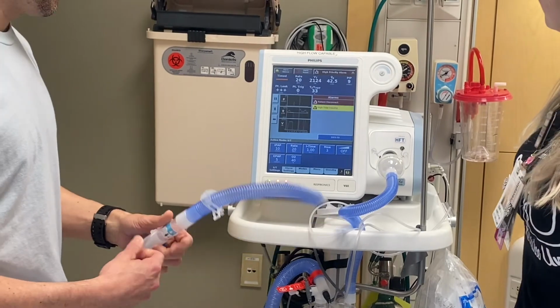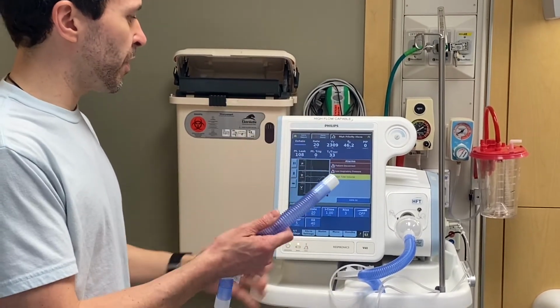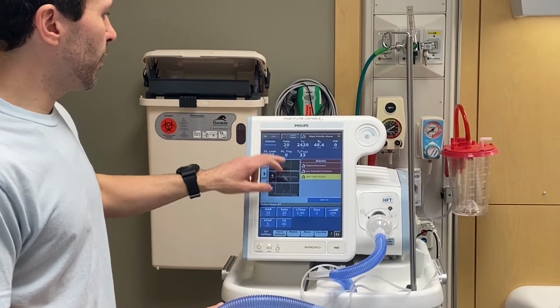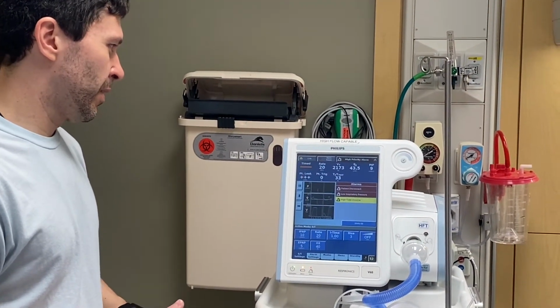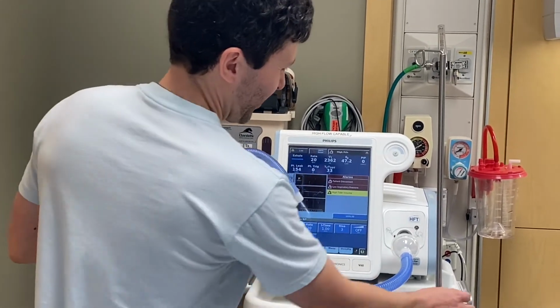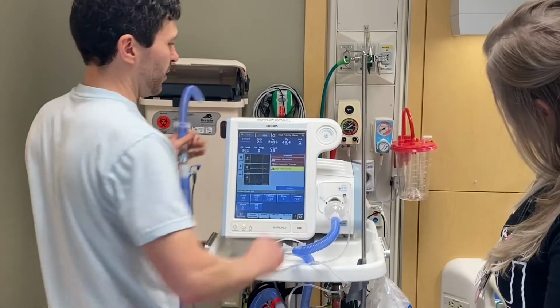It typically does. If you see patient disconnected or proximal line disconnected, and you are staring at the patient and the mask is on and everything's running, that's probably it. Or it has a tremendous leak. It will say patient disconnect if the mask leak is over, like, into the hundreds. So it could just be a big leak, but typically, I wish the proximal line alarm would fire, but I guess I can't control that. So always check these pressure lines too. It's kind of a pain in the butt to put on, but give it a little elbow grease and wiggle it on and it'll be good to go.